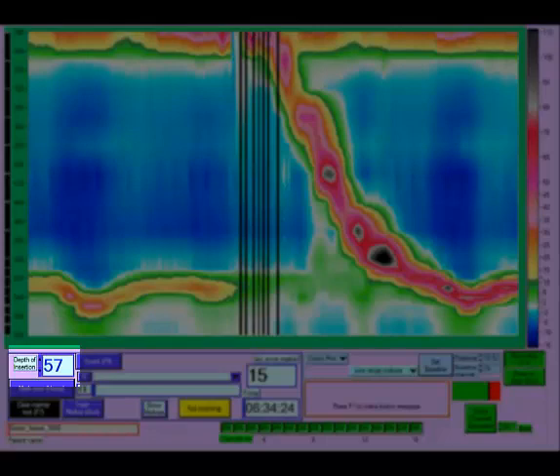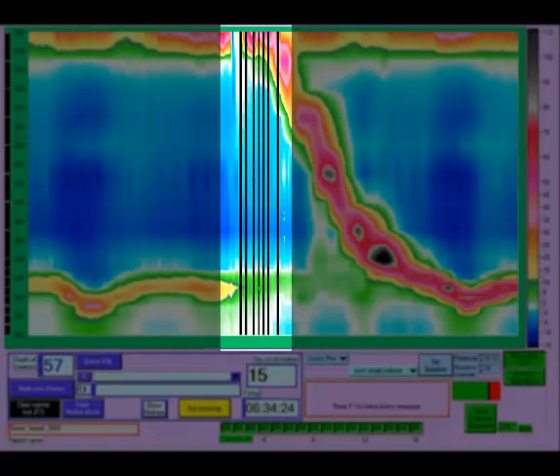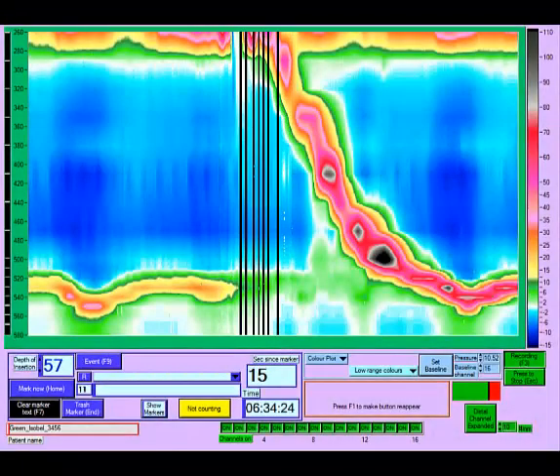For example, if you can see the 57 cm marking at the nostril, the depth control would be adjusted to read 57. Each time you change the depth of insertion control, a marker will be inserted, and a vertical black line on the recording will indicate this.